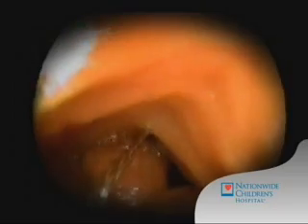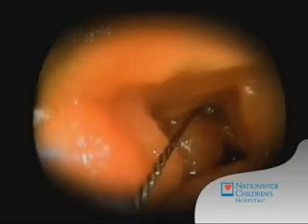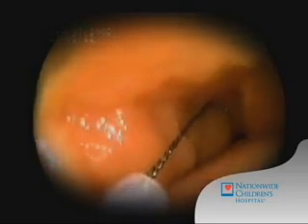The goal, of course, is to make a clean separation between the wall and the lesion, and thereby prevent complications such as perforation at the time of lesion removal.